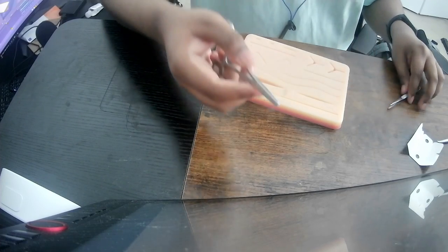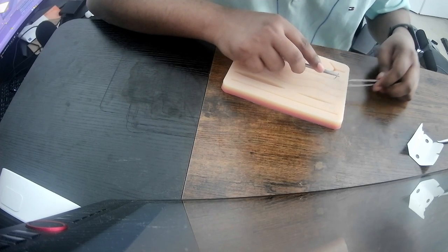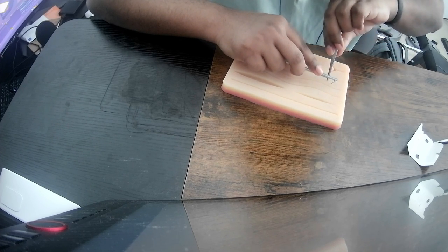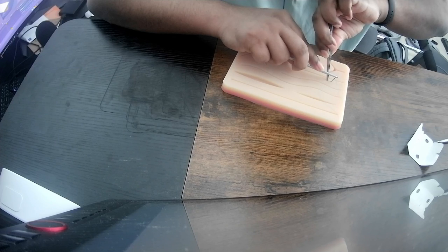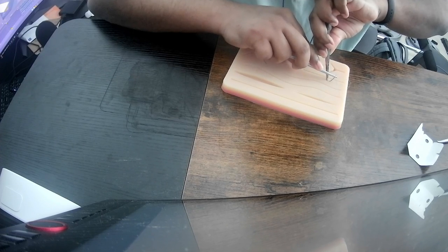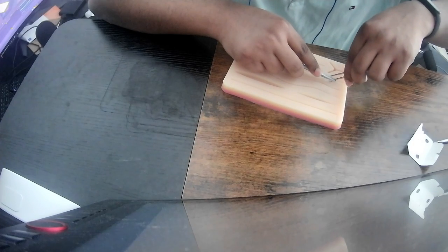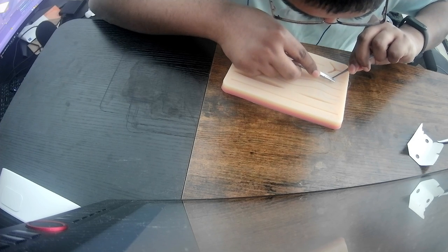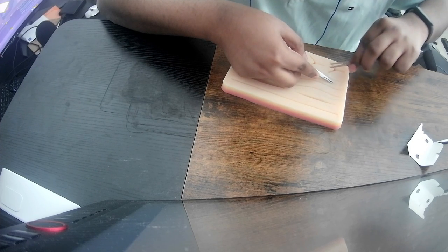Okay, let me see if I can keep going. Okay, let's keep going. I'll be loading it through here. Let's do this. Okay, so holding the skin with my Addison's forceps actually makes it easier to drive the needle. That actually makes sense now why people do that. Of course they do. They wouldn't do it otherwise. Okay, can you see it?